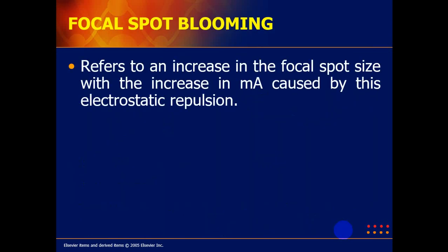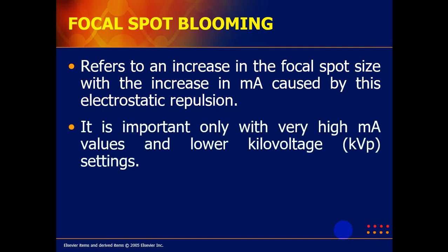We also have what we call focal spot blooming. It refers to an increase in the focal spot size with the increase in mA caused by electrostatic repulsion. It is important only with very high mA values and lower kilovoltage settings.